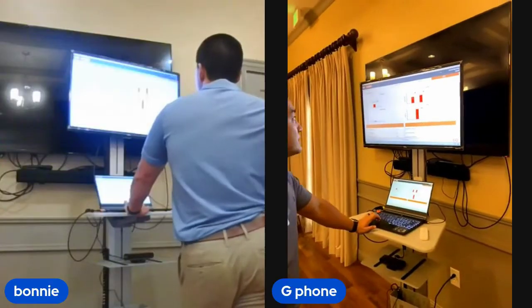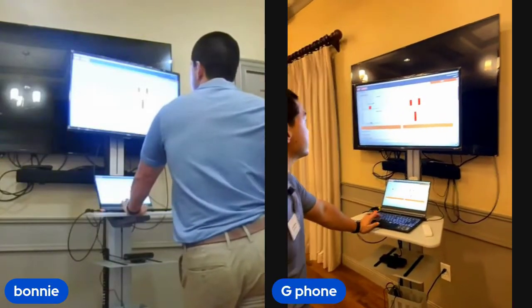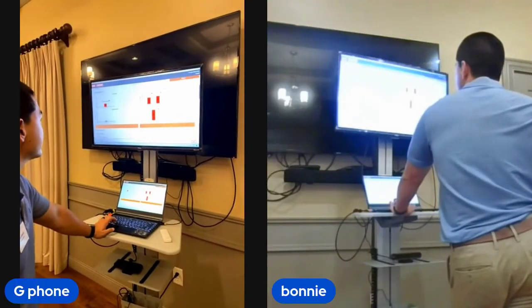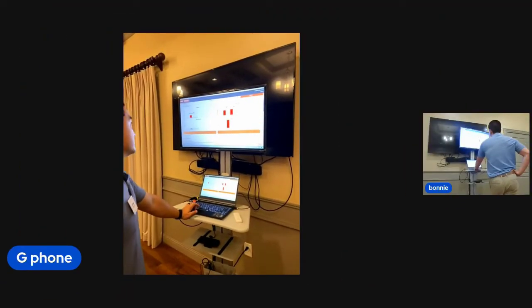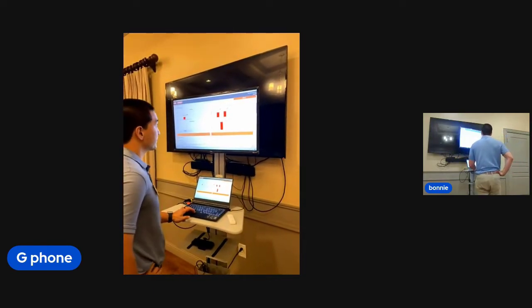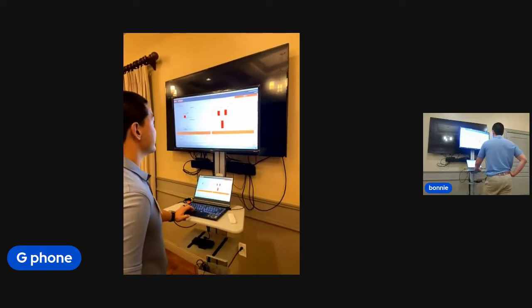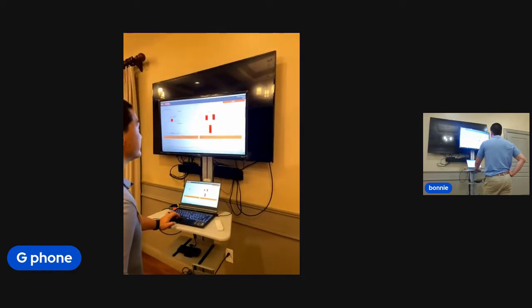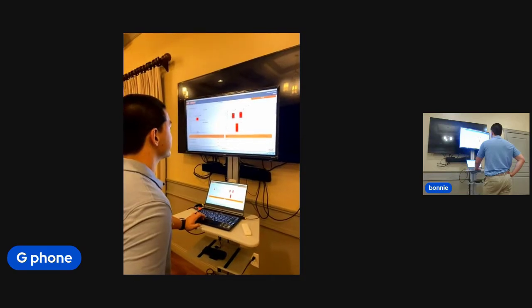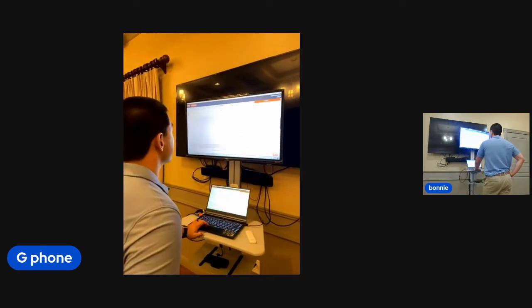So this will show you my step length. Obviously, the gait speeds are much lower. We're trying to get them to 1.16 for this person's age. So we can make a goal to make 1.16 the gait speed. I pretty much had short steps, both left and the right, even though I was trying to make one a little bit longer than the other. But you can see a little bit of a difference. And that's for the gait speed.